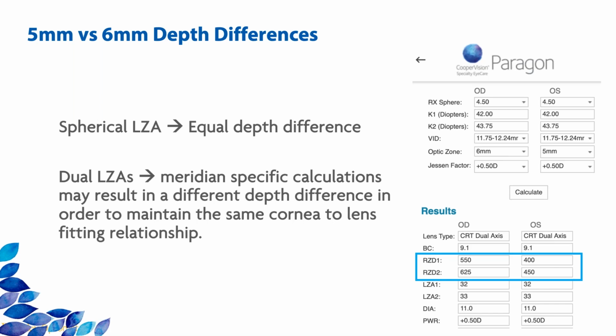With that, I want to open it up to further questions, and we do have a couple here. Dr. Liu, our first question for you actually is from the clinical study. How did you troubleshoot the lenses in the clinical study? For example, if a 5mm lens was temporally decentered, how did you troubleshoot that, and was it different from the 6mm OZD?